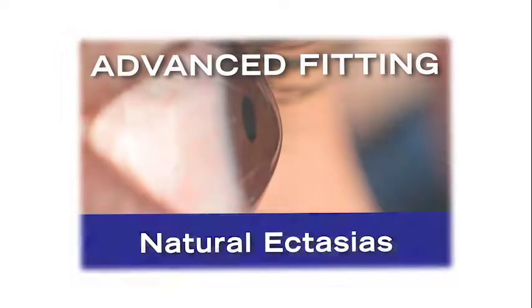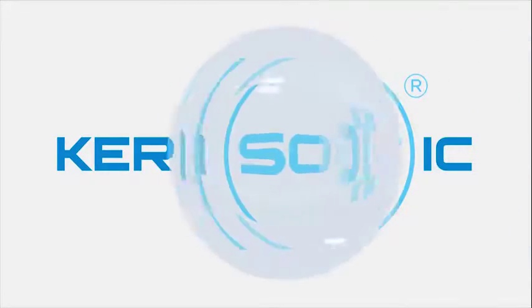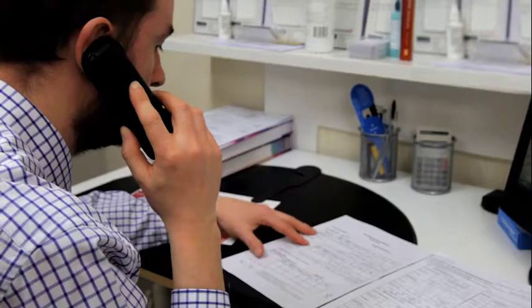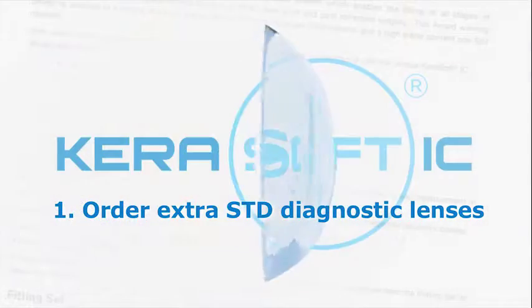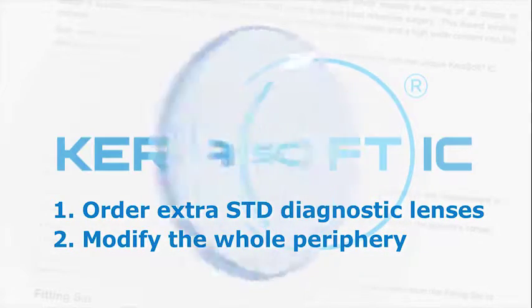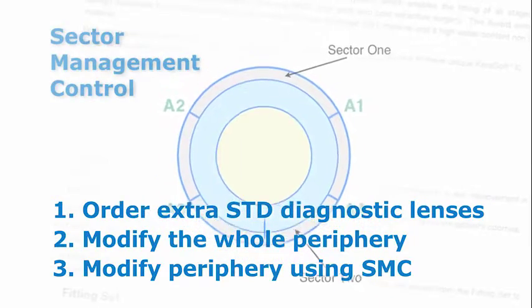When fitting advanced natural ectasias, standard periphery lenses should be tried in the first instance, as they often provide an optimum fit. However, if they do not, the KeraSoft IC lens can be modified by ordering standard periphery lenses outside the range of the diagnostic set, by modifying the whole periphery of the lens, or by modifying a section of the periphery using what is called sector management control.